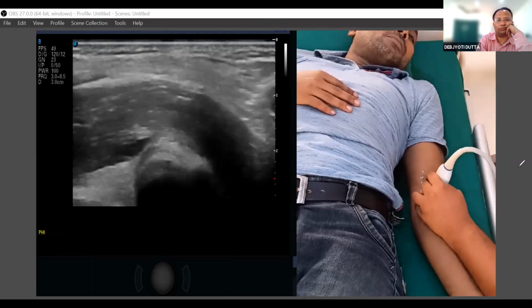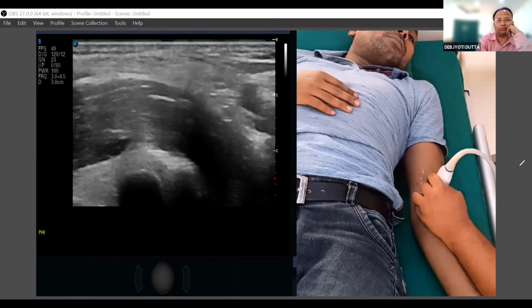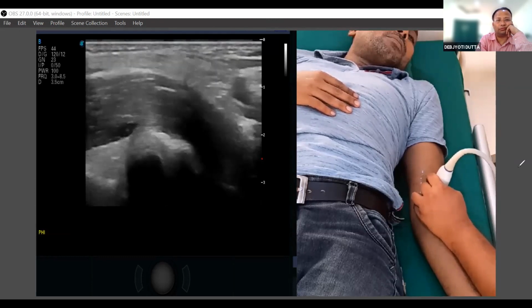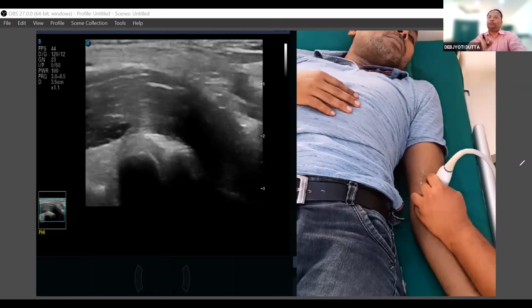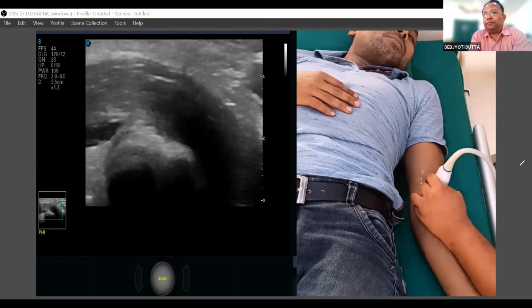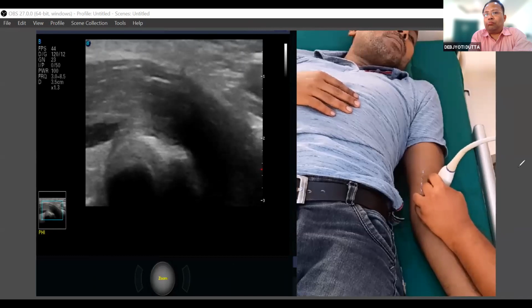Okay. So here we will be able to see. Okay. So I am going to increase the depth slightly, so that you can see it. Let me zoom a little also. Okay, fine. Depth.